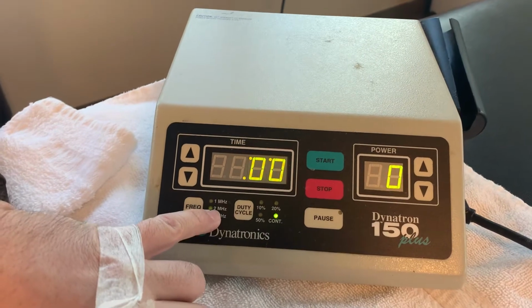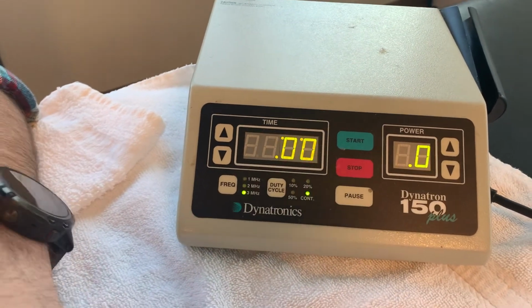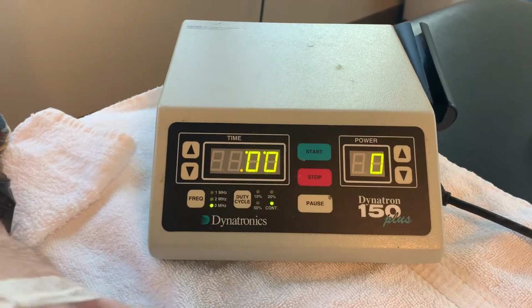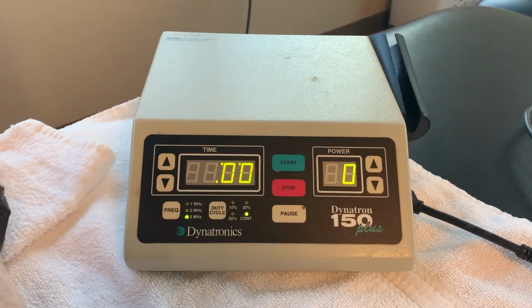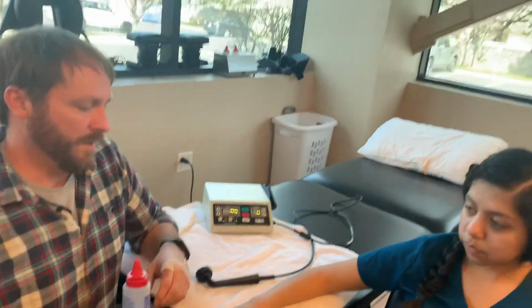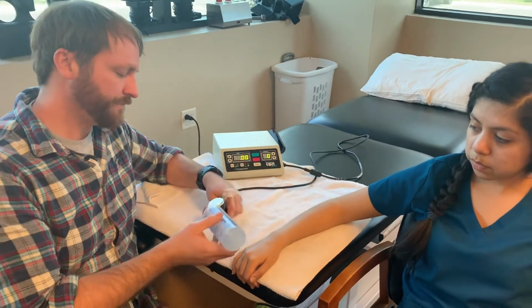Same thing with 2 megahertz right here. Not a lot of research done specifically on 2 megahertz ultrasound, but you can imagine if the 3 megahertz penetrates about 2 centimeters and the 1 megahertz penetrates about 5 centimeters, we're sitting at about 3.5 when you go to a 2 megahertz setting. So again, that depends on the impedance of the tissue. Muscle is going to have a little higher impedance than subcutaneous tissue or fat.